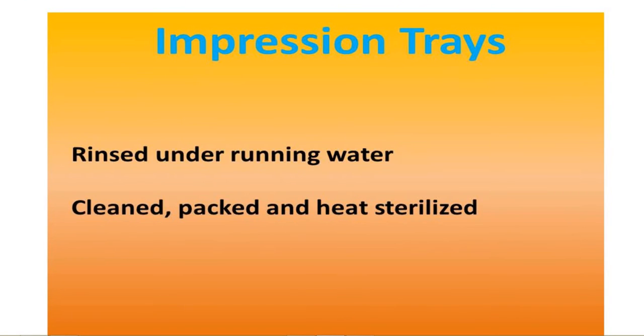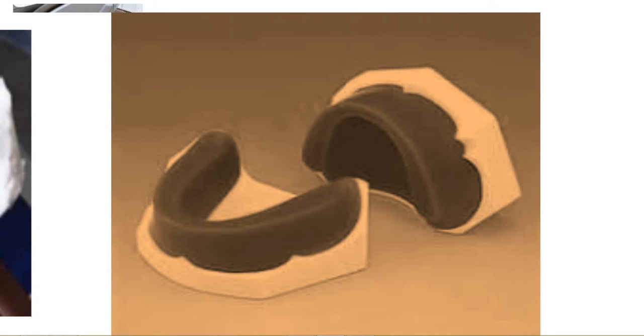Coming on to disinfection of wax rings or the wax bite or the occlusal rims, which are known as delicate materials due to the nature of the wax, and disinfection can be done without distortion by chlorine dioxide or sodium hypochlorite spray or iodophor spray, and spray-wipe-spray technique can be used. Following the second spray, the wax bite can be enclosed in a sealed plastic bag for proper contact time. The bite should remain wet with disinfectant for the time recommended.